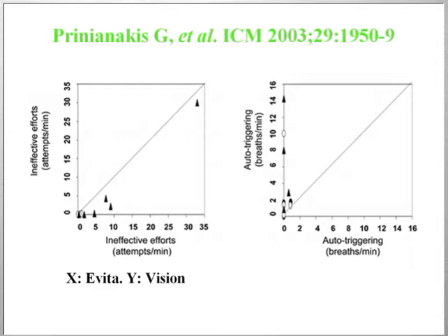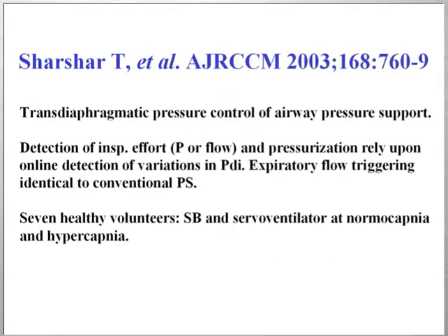So you have to keep an equilibrium between a very high sensitivity, decreasing the number of ineffective efforts, but perhaps paying the price of undesirable auto-triggered breaths.